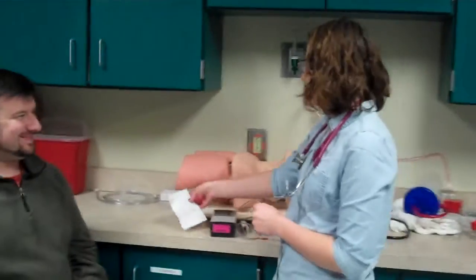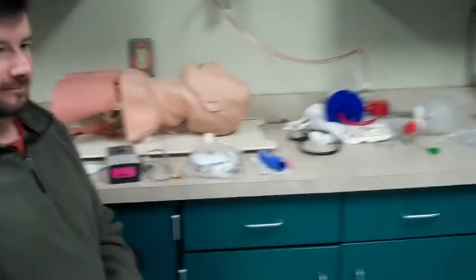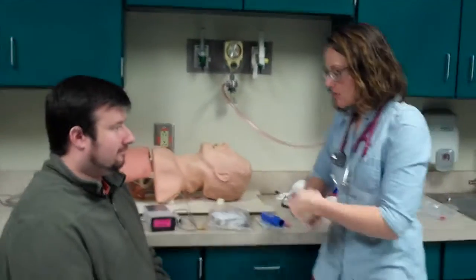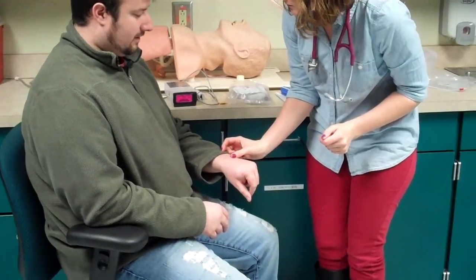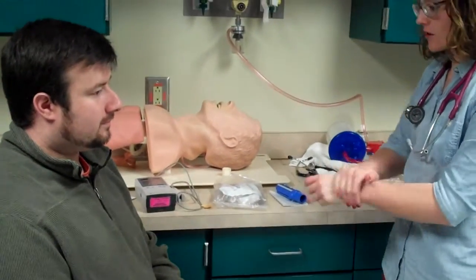I'm going to take all of my equipment. Hi, I'm Victoria. I'm from Respiratory. I'm here to give you a breathing treatment today. I'm going to wash my hands. All right. Can you give me your name and date of birth, Daryl? Daryl Walters, May 26, 87. All right. I'm going to make sure that's what I have in my chart and it's correct.